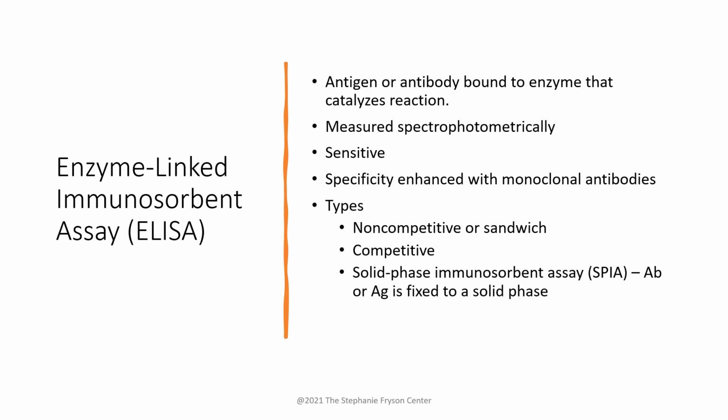There are more than three types, but the main types are the non-competitive or sandwich type, and then there's a competitive type, and then there's the solid phase immunosorbent assay. This is where antibody or antigen can be fixed to a solid phase to detect whatever you're looking for.